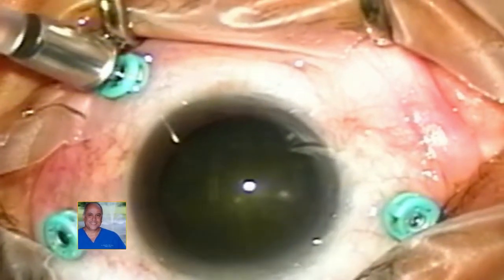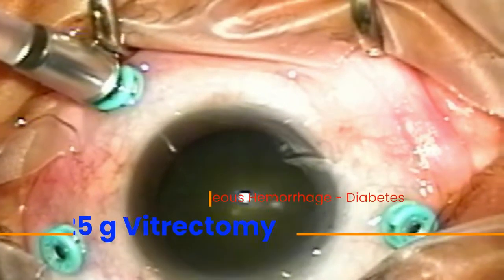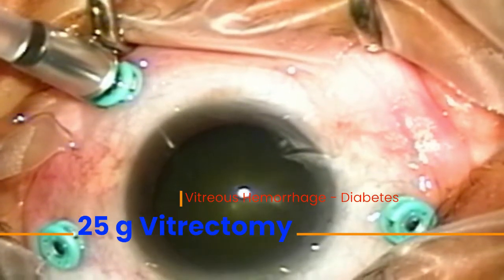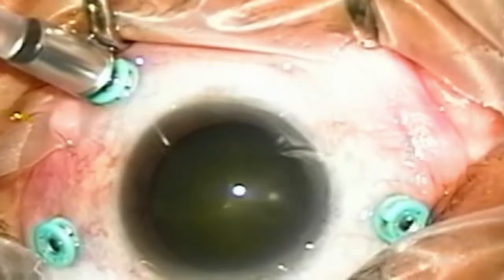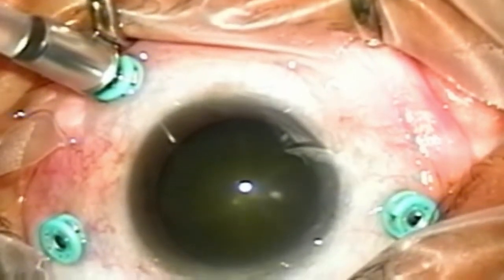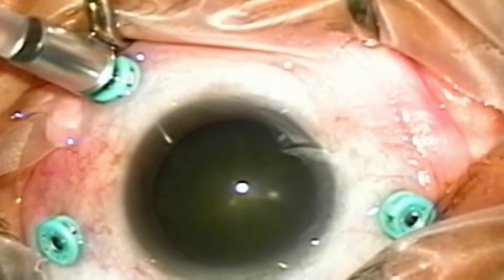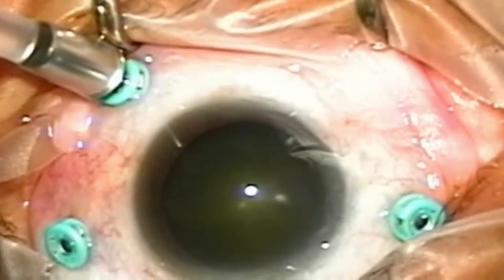Hi, this is Nader Moinfair, and welcome to this video of a patient that has a hemorrhage inside the eye from diabetes. Today we're going to be removing the blood from the inside of his eye, trying to remove all the relevant scar tissue, and then apply laser.